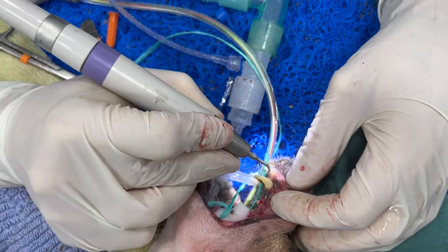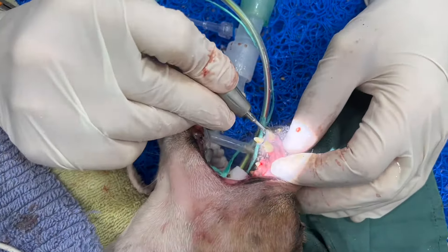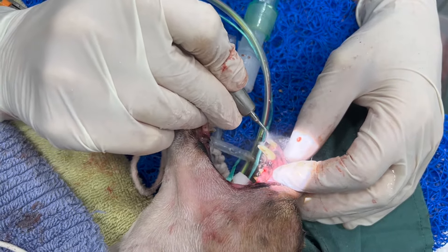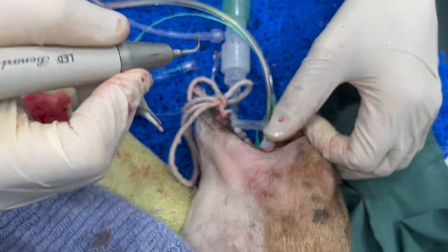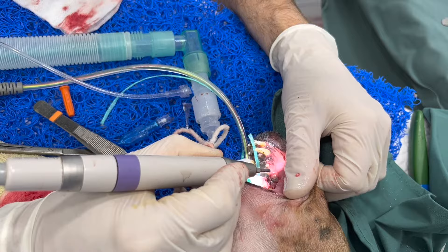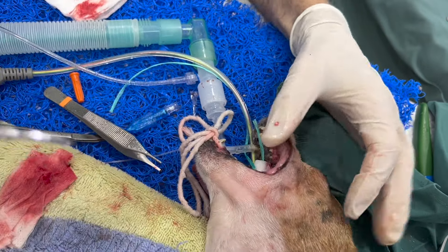The tartar is just so thick it's hard to scale at all. And ideally, you don't want to scale in one spot for too long because it actually gets quite hot — that's why there's water flowing the whole time.